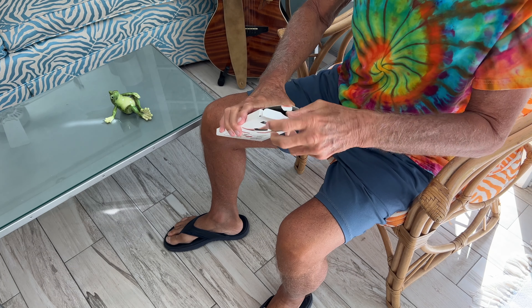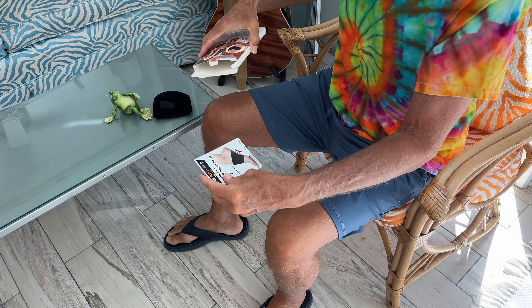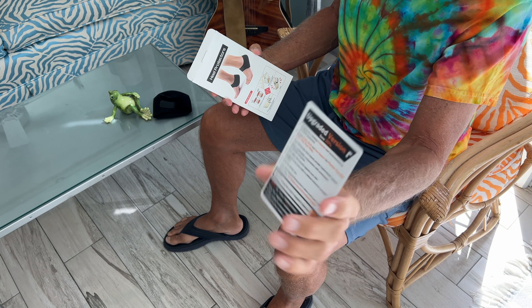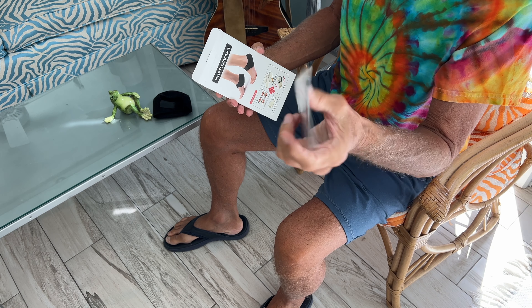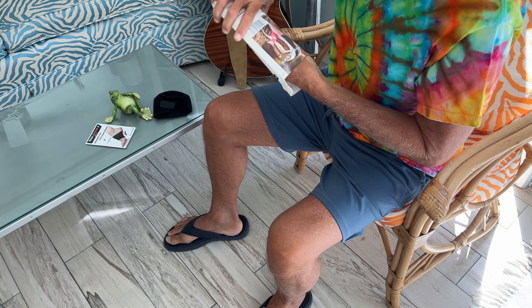Let's open them up. There's two of them in here. They've got a little doohickey here. You can get an upgraded version of it — wish they had told me about that earlier. And then there's the other one.